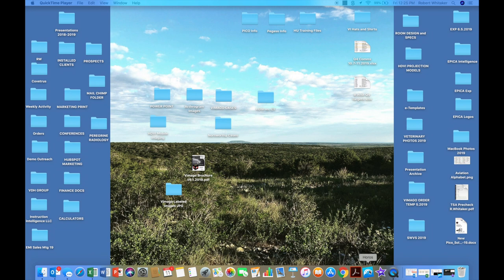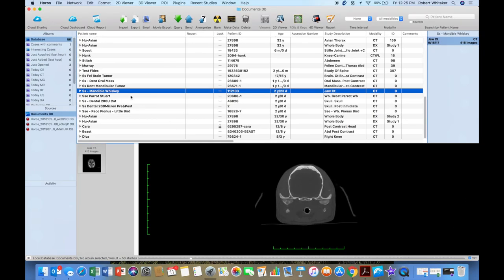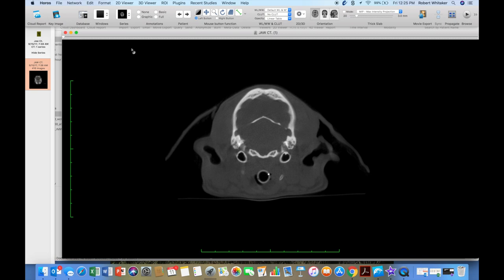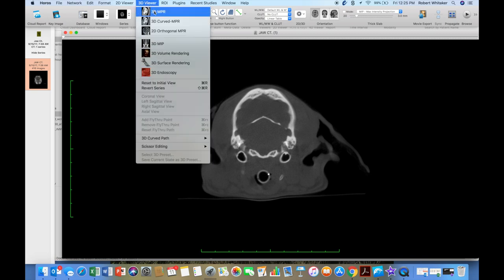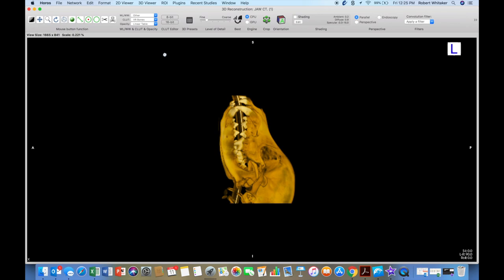We're going to export a short movie out of Horos now of a 3D. I'm going to open my case by double-clicking on it. I'm going to go to my 3D volume rendering.